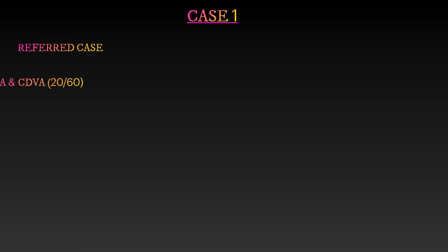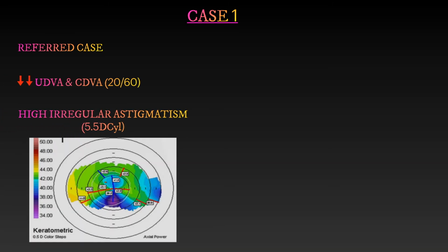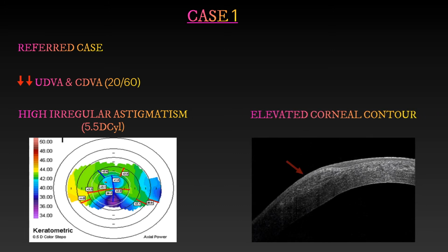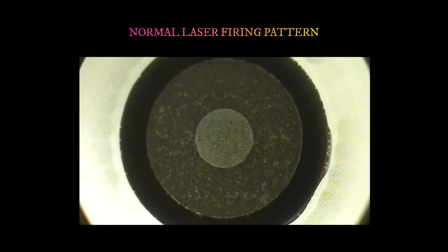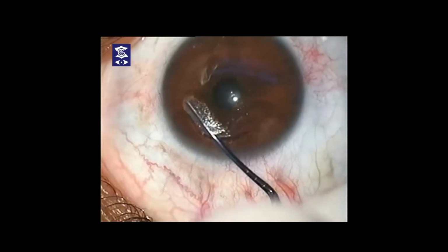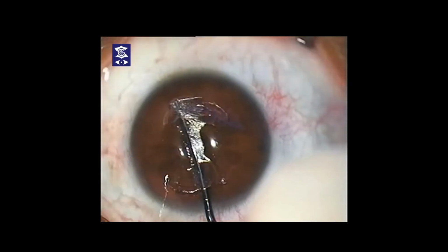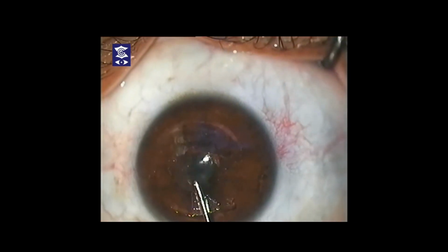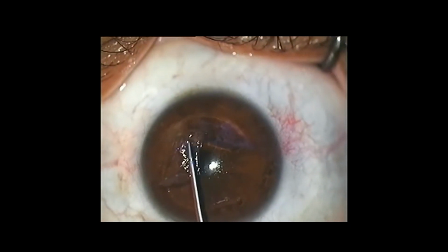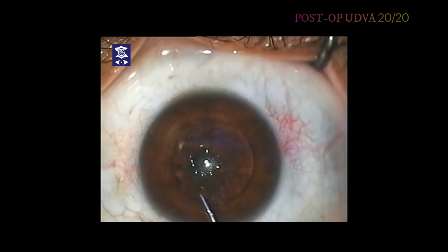This referred case presented with reduced visual acuity, high irregular astigmatism, and elevation in corneal contour on ASOCT, signifying a retained lenticule. Surgical video showed normal laser firing pattern. Pocket exploration through old SMILE incision was carried out to separate the lenticule from surrounding tissue bridges, followed by its successful removal and restoration of unaided visual acuity.